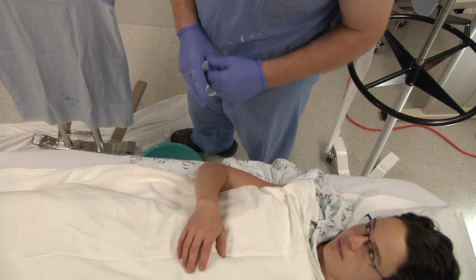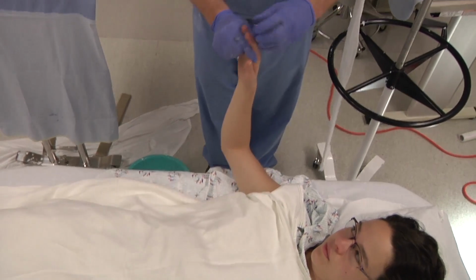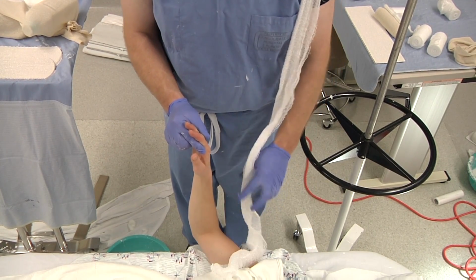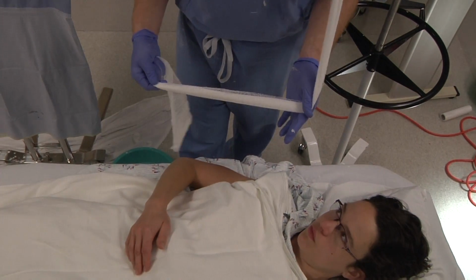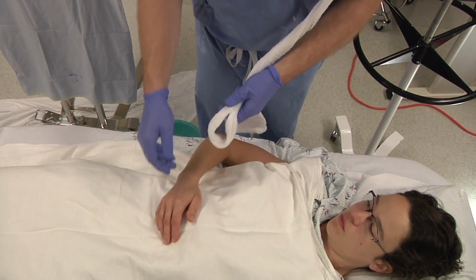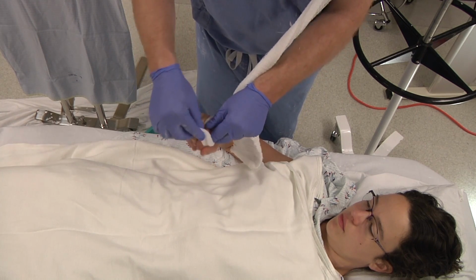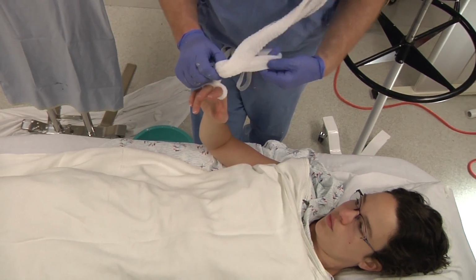So the first thing that we do generally is get the patient in some sort of traction, if it's a distal radius or a carpus fracture. You can either do that with finger traps, or if you don't have any of those available, it's very easy to take some web roll, make a loop, put the loop generally between the index and middle fingers, and then loop it over those two fingers. Gives you a little cinch there.